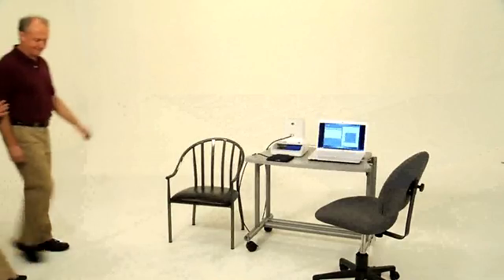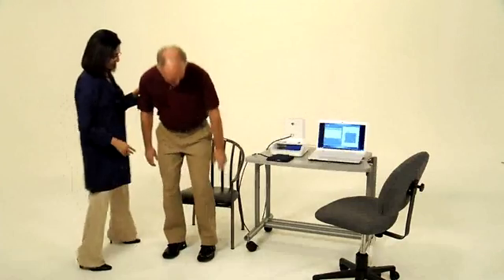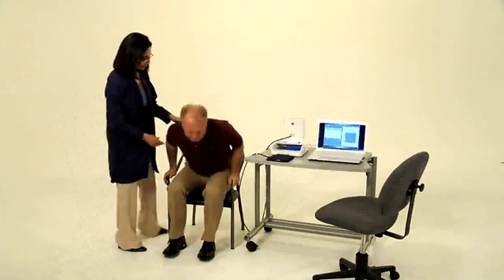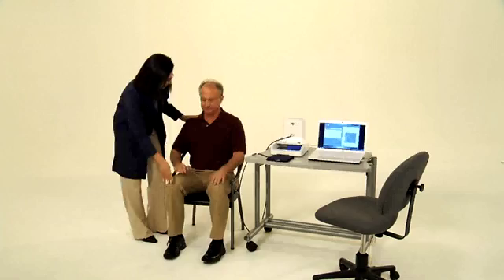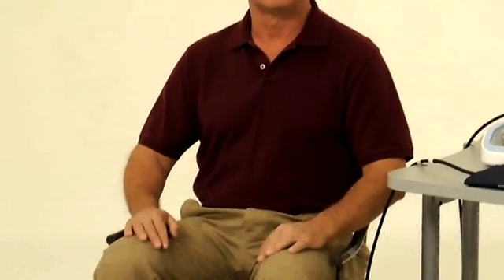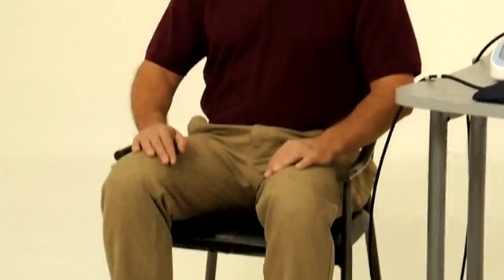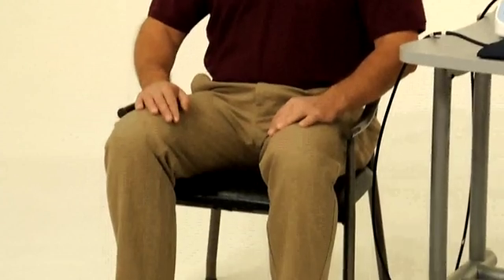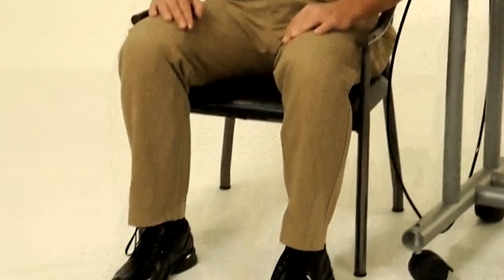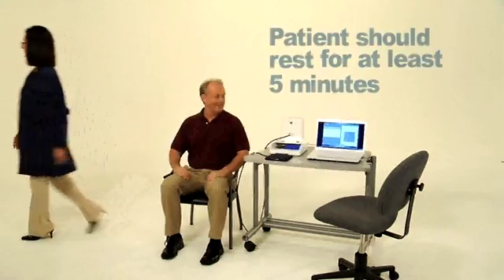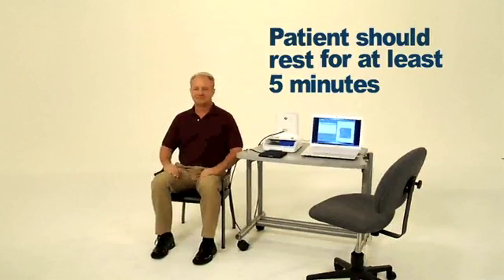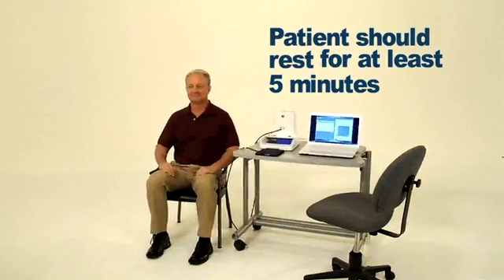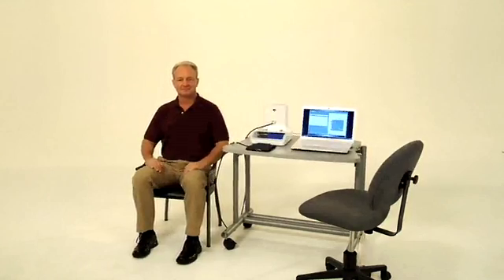To prepare for pulse wave analysis, follow proper protocol for brachial blood pressure measurement. Seat the patient in a chair so that his back is supported, making sure his feet are not crossed and are on the ground. The patient should rest in this position for at least five minutes before measurement begins and remain in the seated position throughout testing.